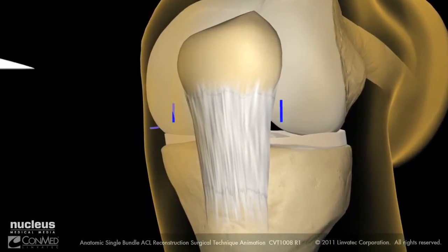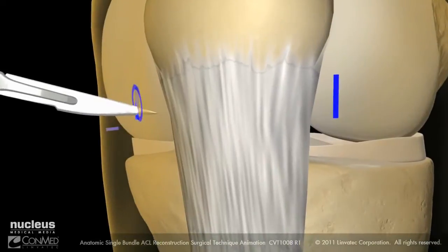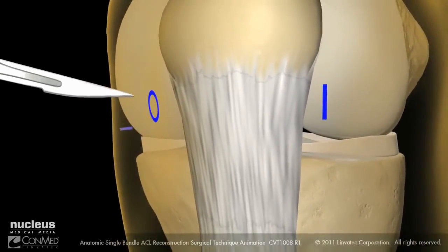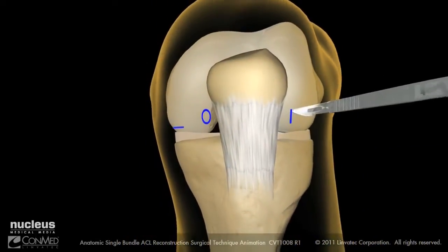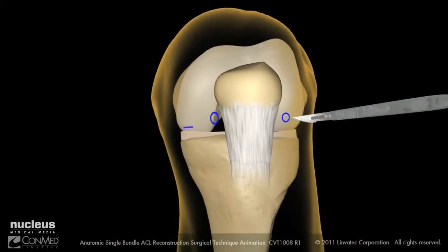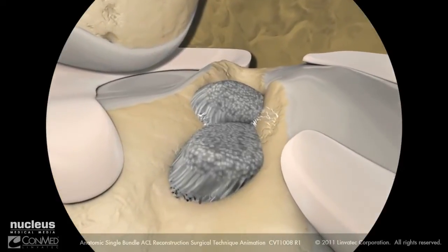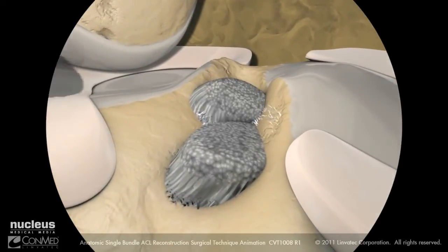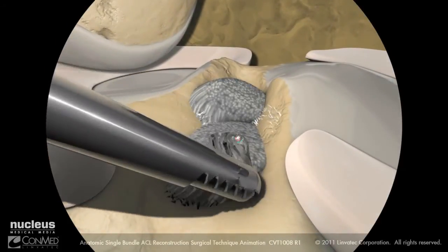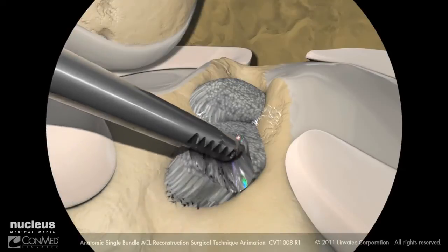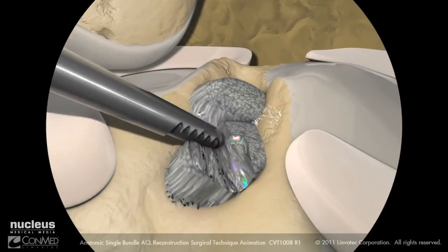With the surgical markings in place, incise the anteromedial and anterolateral portals. Insert a ConMed Linvotec shaver to excise any remaining ACL tissue.